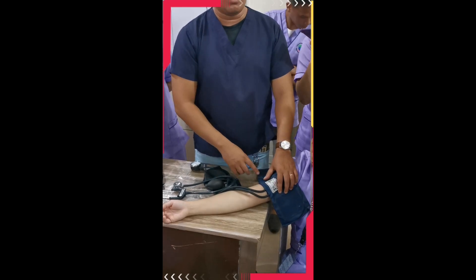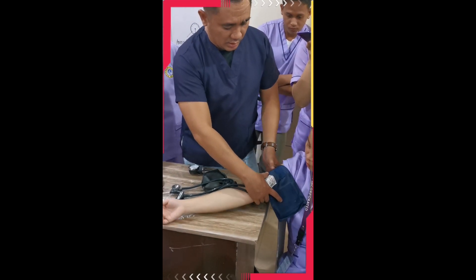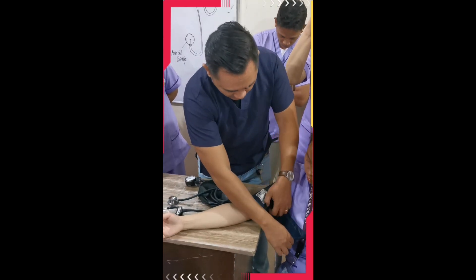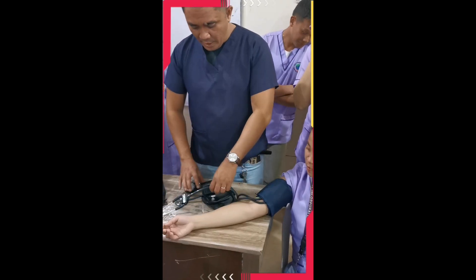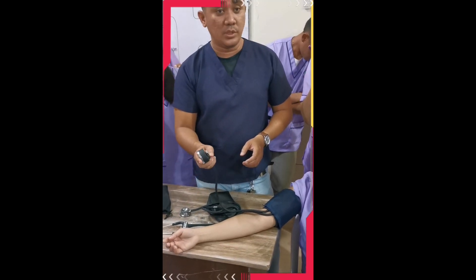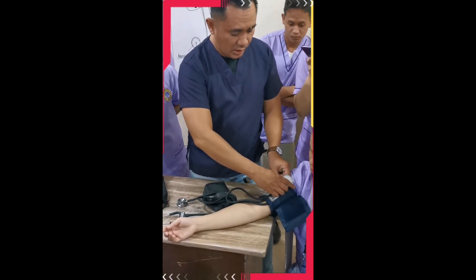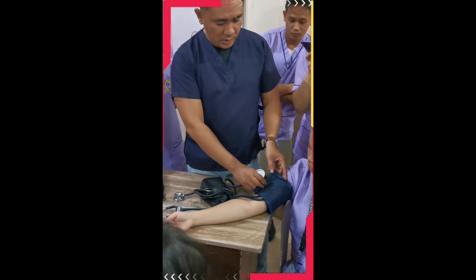When applying the BP cuff, make sure the arrow aligns with the brachial artery. If there is no arrow marked on the BP cuff, align the tubes to where you found the brachial artery. The cuff should not be too tight and not too loose. For the gauge, at the back there is a hook or clip — you can clip it onto the BP cuff. If there is no hook, you can tuck it in between the BP cuff. Make sure the gauge is visible.